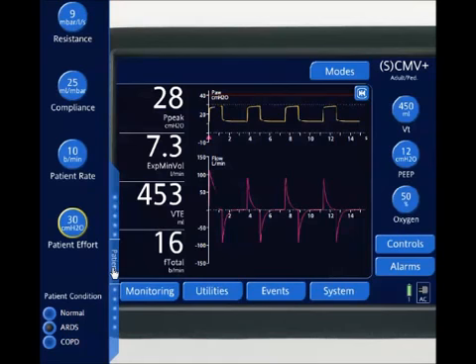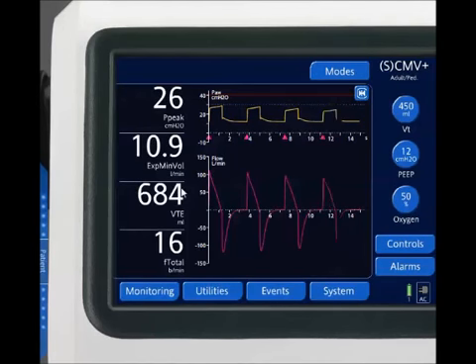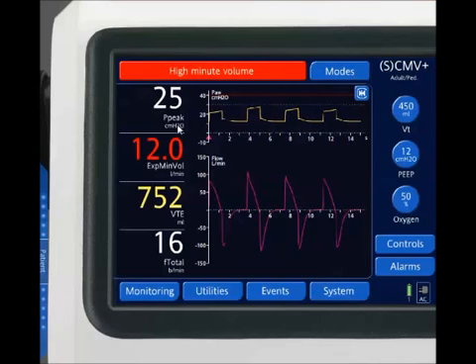So I'm just going to close this out, and we're going to look at my measured values. My minute ventilation demand is going to go up significantly. The patient's going to be sucking back so much that my measured tidal volume is going to be more. They're going to get a larger volume for the amount of pressure. So this created a high minute ventilation of higher tidal volumes.